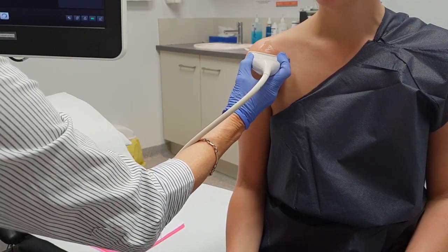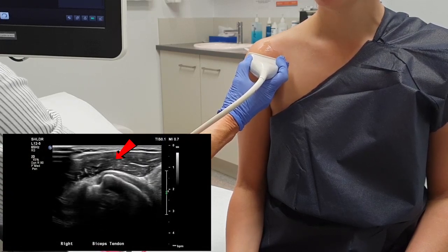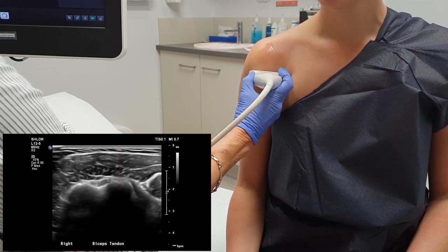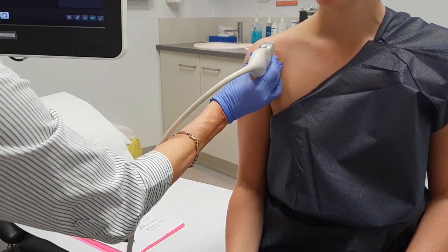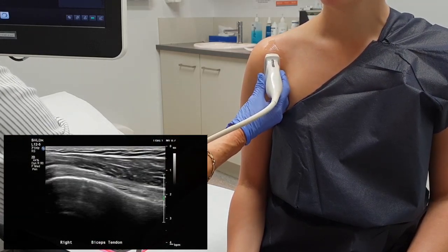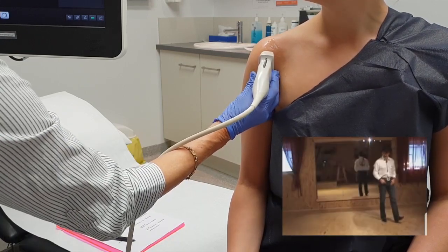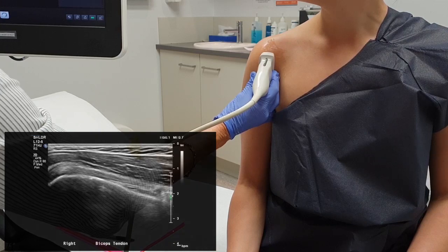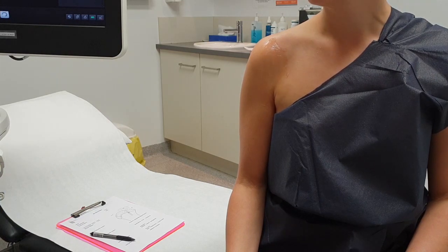I always have a look at the biceps tendon in transverse first, to make sure that that biceps tendon is sitting nicely in the bicipital groove, and you work your way down the shoulder, seeing whether the biceps are surrounded by fluid or not. Once you've had a look in transverse, you spin around into longitudinal — the longitudinal position is where you see the beautiful fibrillar part of the tendon. You do what we call heel-toe, which means you give a little bit more pressure to the transducer so that you can actually see the fibres of the tendon. Once we've done the biceps tendon, we'll do the subscap.